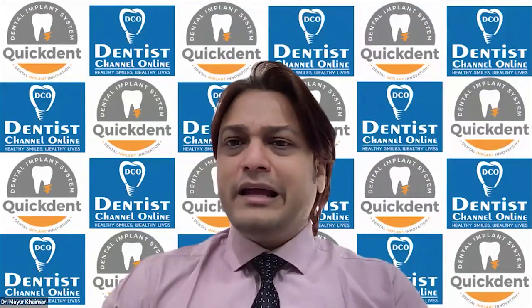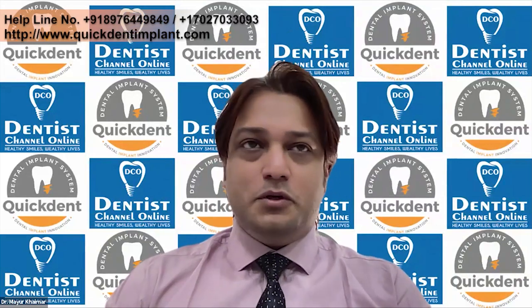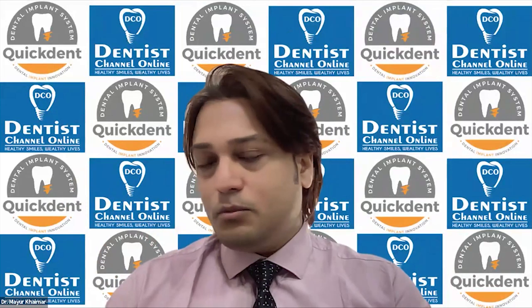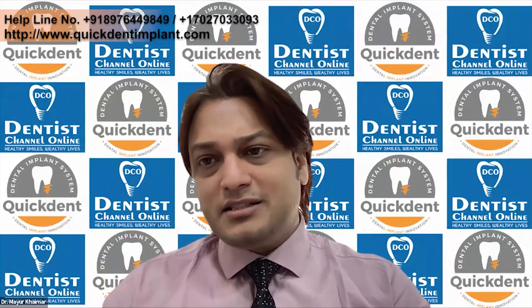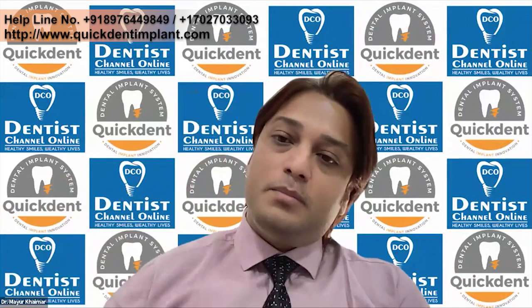35 to 40 drilling angulations depend totally on you. You can place 0 degree, 17 degree, 30 degree, 45 degree, no problem. In zygoma cases, you can do 52 degree and 60 degree also. It all depends on bone anatomy and how you're placing.